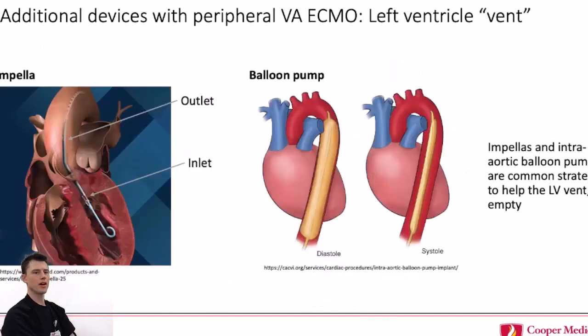All right, what are some other devices? So we talked about how that ventricle... I'm sorry to interrupt you. The indication for Foresight in a patient on VA ECMO is to measure their tissue oxygenation. We have the capability of doing that with our Swan box. So make sure if you have a patient on VA ECMO that you put the monitor on both lower extremities. Because that will give you a clue that you're having a perfusion problem before any other indications. Yeah, a very good point.